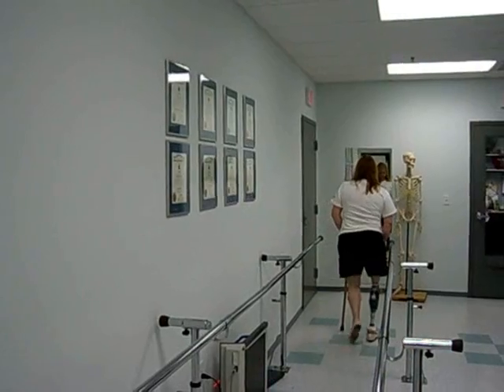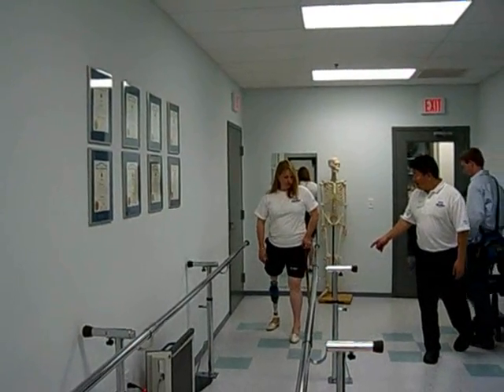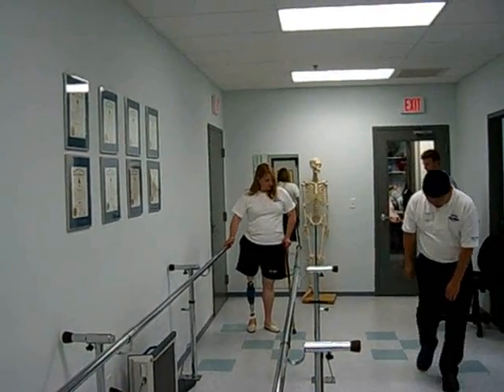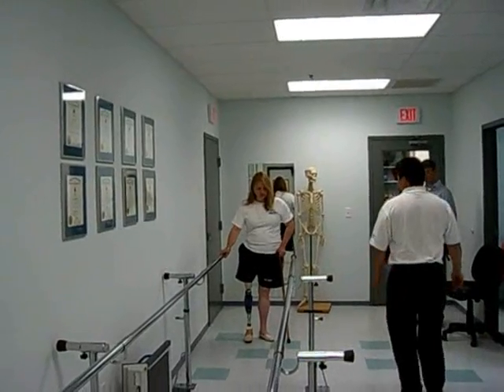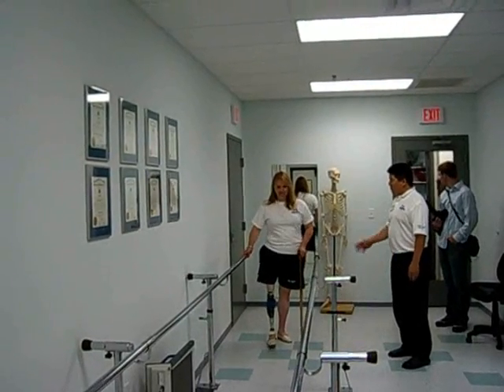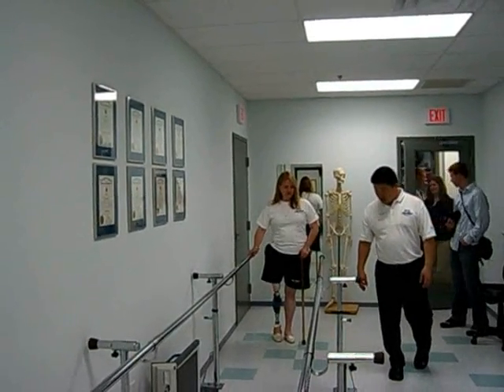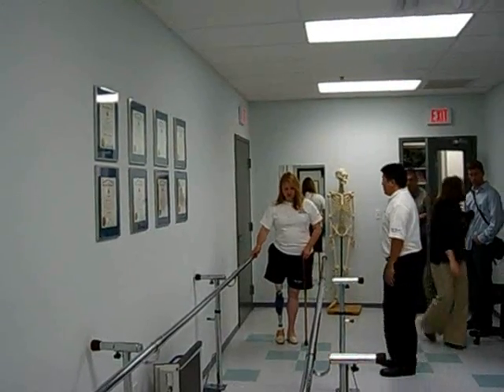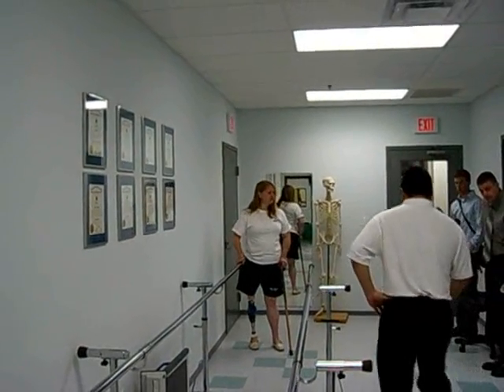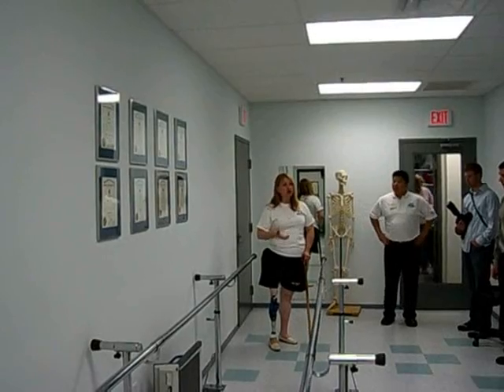The knee will not buckle on you. Now, on your left side, you've lost this shock absorption. On your left side — I'm not staying as long as I should be? No. What happens is when we walk, your knee bends and it's absorbing impact. I think for so long you've been compensating that the knee is straight on the left side. Exactly. So we want the right side to do what's natural — it's going to bend a little bit, then you're going to straighten it out. As you walk over it, that's what's going to absorb impact. It also keeps your center of gravity consistent. Otherwise you're going to walk over it, which uses more energy. You're right — because I always feel like my leg is long even though it isn't.